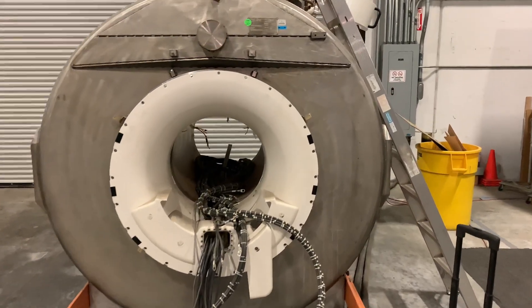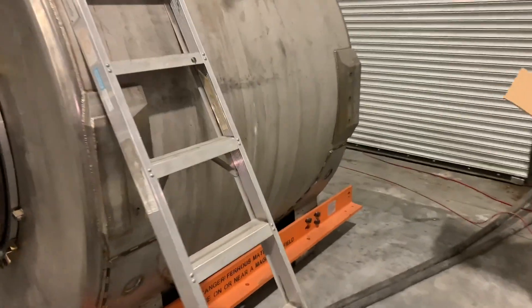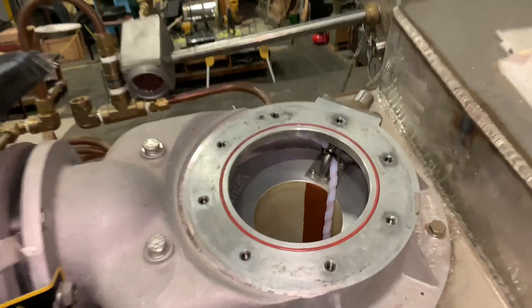Today we're taking a look inside an MRI magnet. Under normal operation, this superconductive magnet is filled with over 1200 liters of liquid helium, and viewing these ports would be nearly impossible, so let's take a quick look.